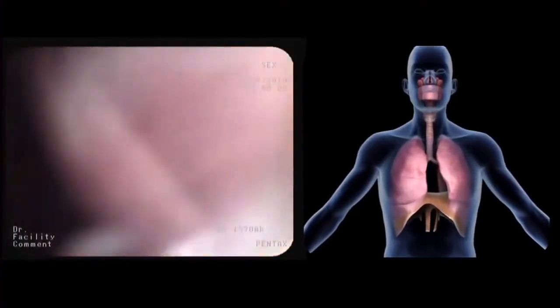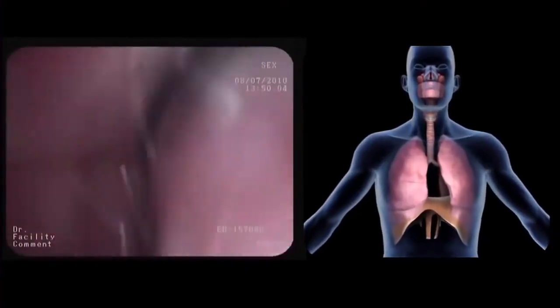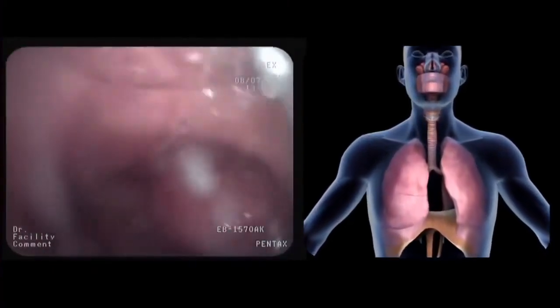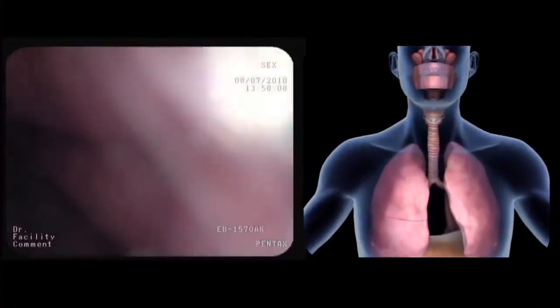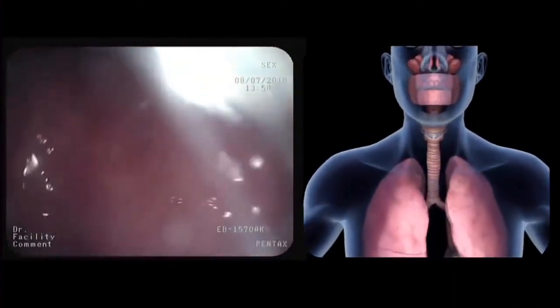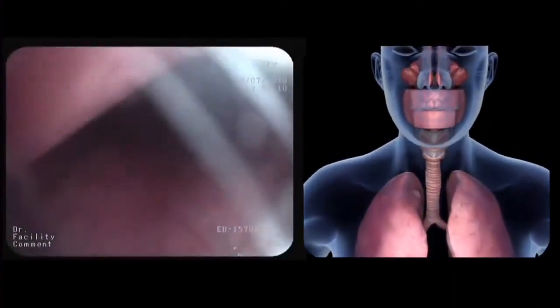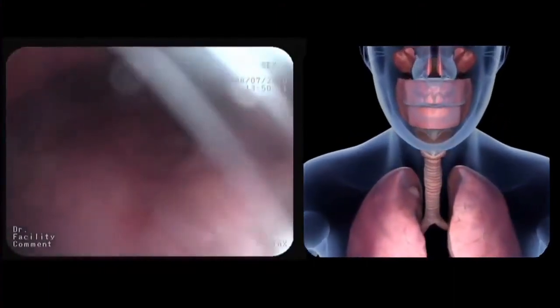In this film, we perform a tour of the normal segmental anatomy of the bronchi by means of bronchoscopy on a healthy volunteer under local anesthesia.